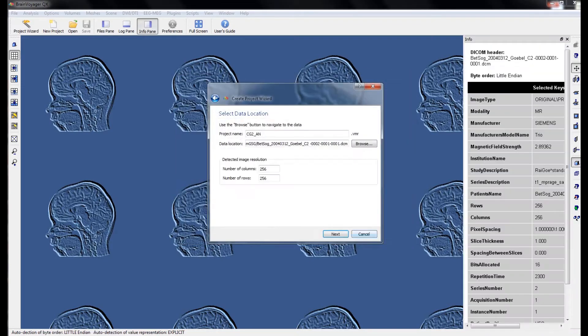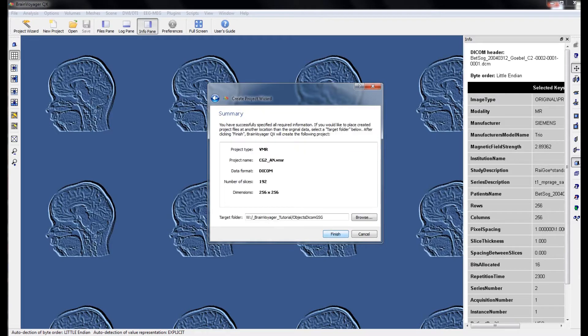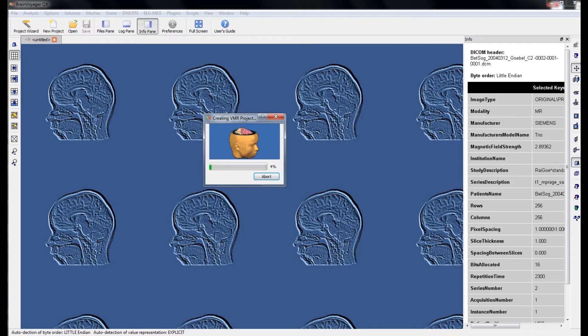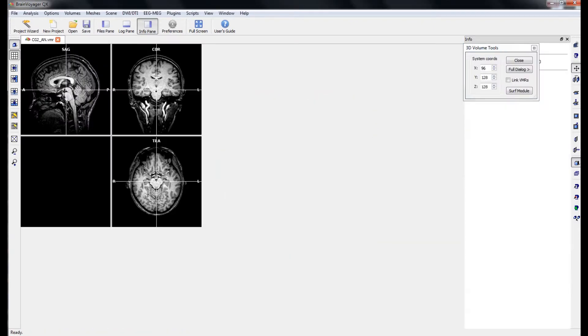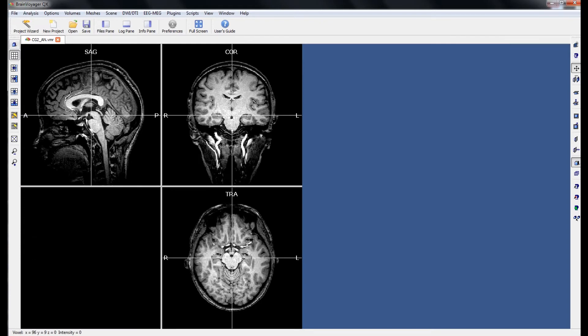From here, from the DICOM header, BrainVoyager will read in all the information it needs to know to reconstruct the project. From here, we can select Next, and BrainVoyager will start reconstructing the VMR. When this is done, we can click OK to accept the default brightness and contrast, and also close the information pane.